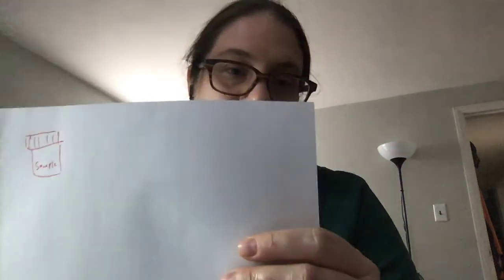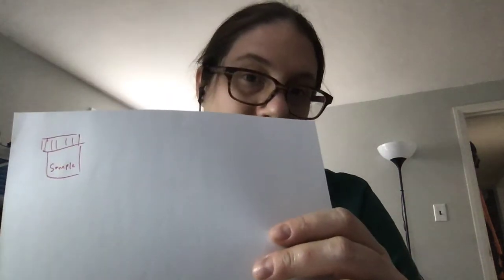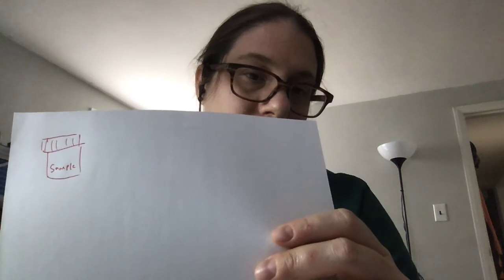Okay, so what you do is you have your sample. We have our sample container here. Let's say this is either urine, or blood, or spit, or something. And then we might have done an ion exchange already. We might have done some kind of separation already, but we might not have.